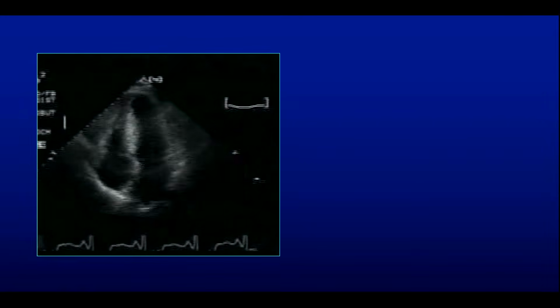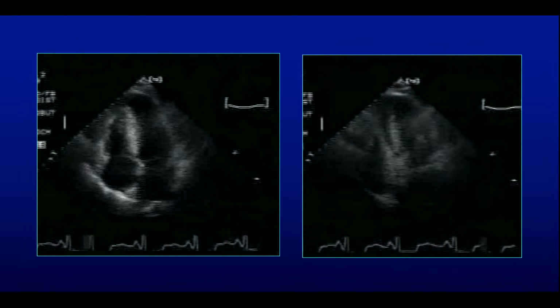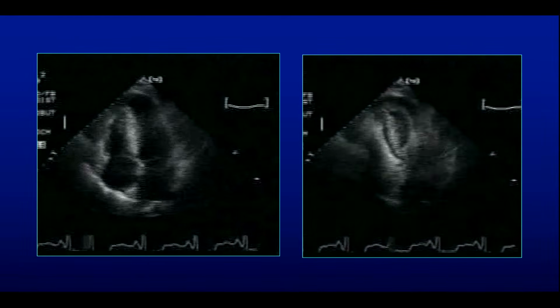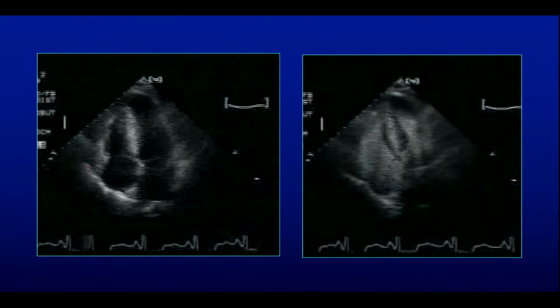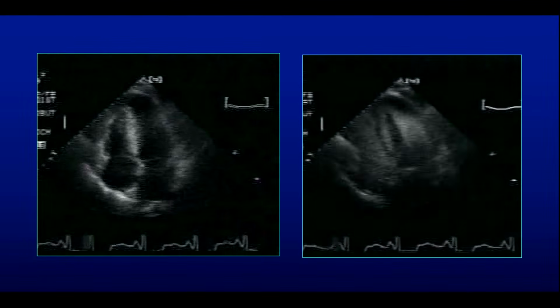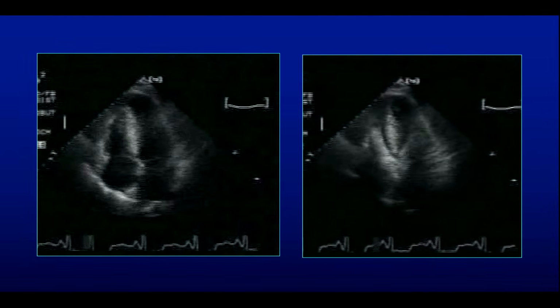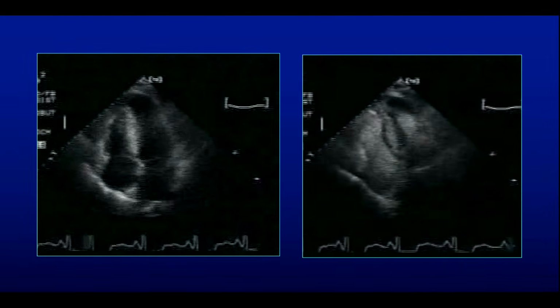Two of them are older, but I'll keep it because you can tell the ventricle is hyperdynamic. What can you tell about the apex? Not sure, right? Use contrast, it changes everything, right? So this is a hypertrophic cardiomyopathy with almost a little entrapment of the apex itself. The ventricular function is hyperdynamic with a very thick septum.